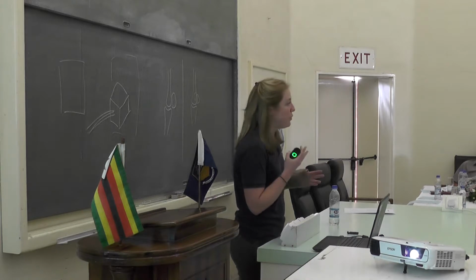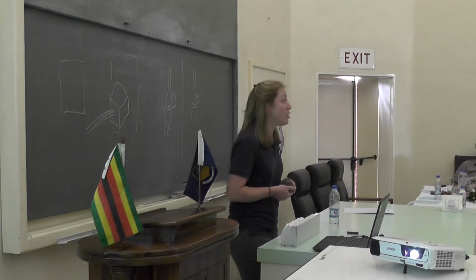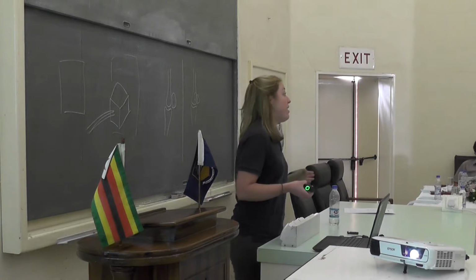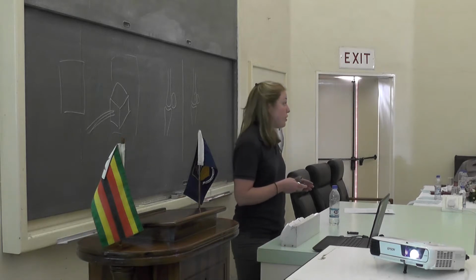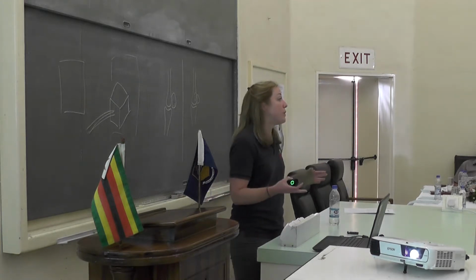And I'm just going to talk about the distal limb on this one because, as Ben mentioned, in equine medicine, if you're looking at donkeys or horses, and certainly in working animals, lameness is incredibly relevant, and it's very, very prevalent. So you will find that if you ever end up in equine practice, you will be predominantly imaging the limbs in terms of X-ray. Doesn't mean that that's all you can do, and we'll cover that later, but this will be a very big part of what you do, because that's where most of the pathology will be in terms of lameness.